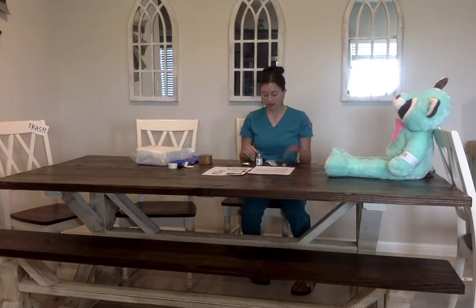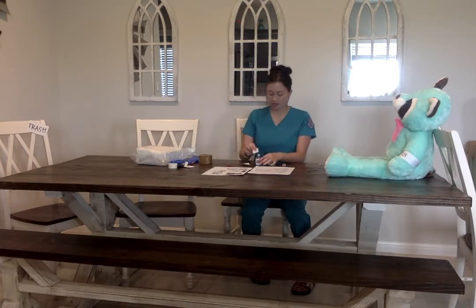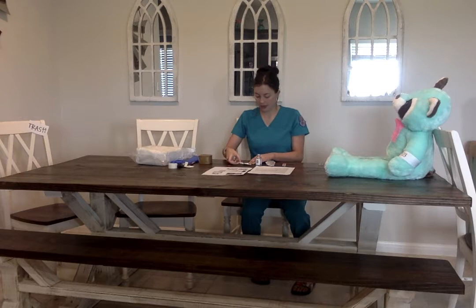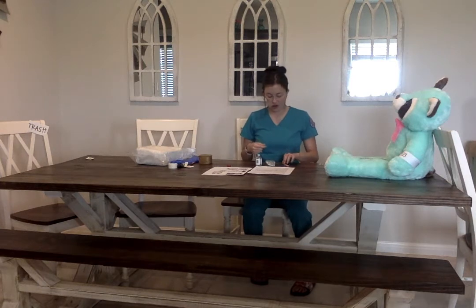So I'm going to go ahead and prepare my meds. Like I said, I have gloves on, and that's my trash bin over there. I'm going to start by cleaning the top of my vial from inner to outer for 30 seconds. Okay. Trash over there. I have a blunt tip needle.